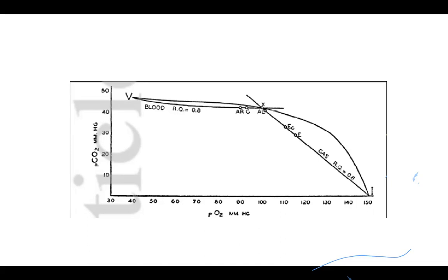Further, we can calculate this inequality of ventilation perfusion ratios by calculating the PO2 difference between the ideal alveolar gas and the arterial blood gas. Physiologic shunting and others can be calculated using the shunt equation and other parameters, but these are all indirect methods of measuring lung efficiency.